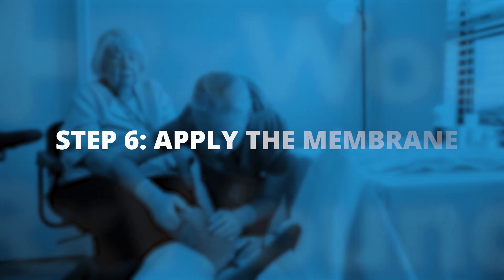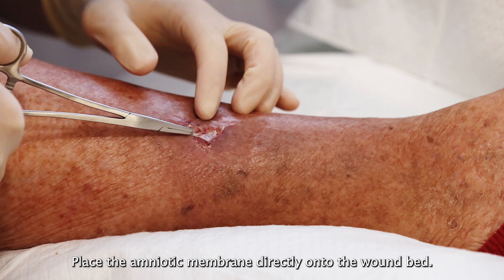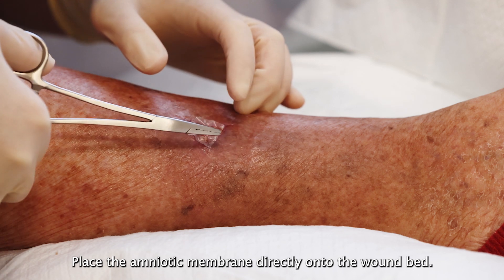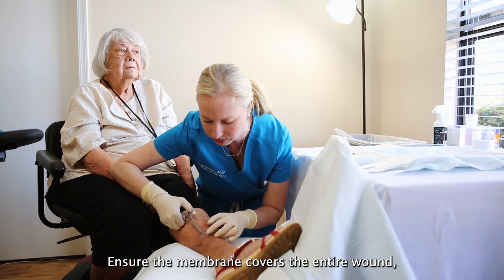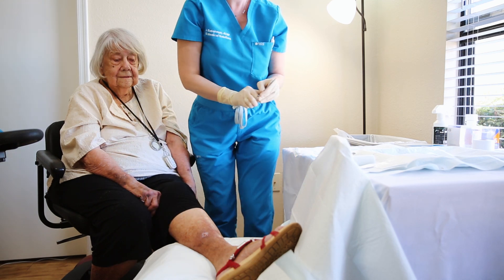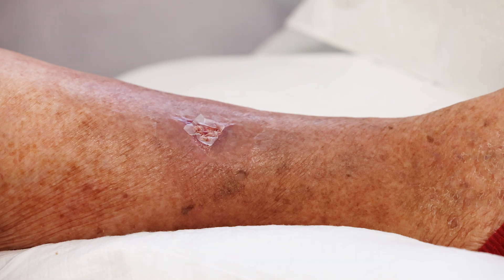Step 6: Apply the membrane. Place the amniotic membrane directly onto the wound bed. Ensure the membrane covers the entire wound, extending slightly beyond the wound edges.